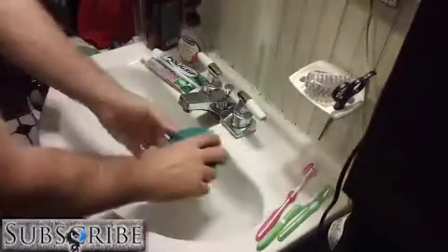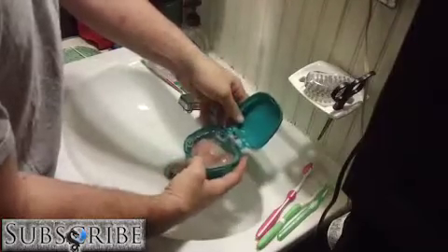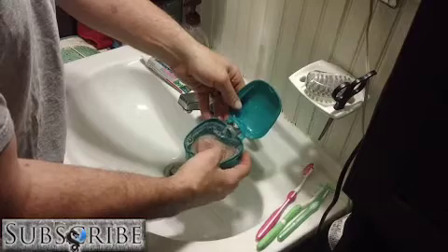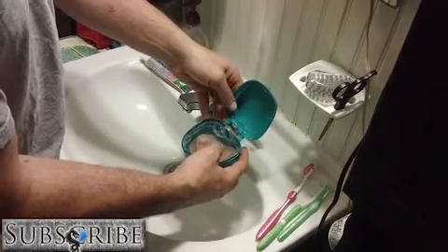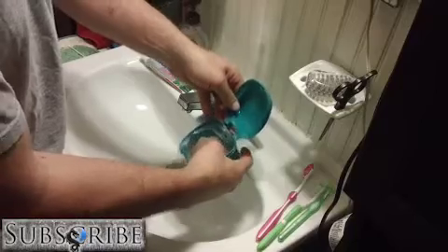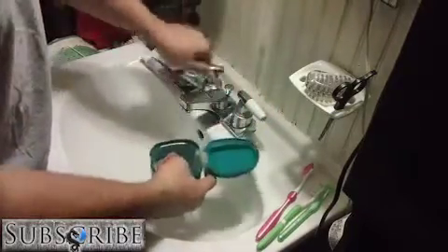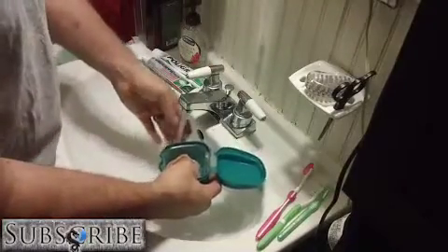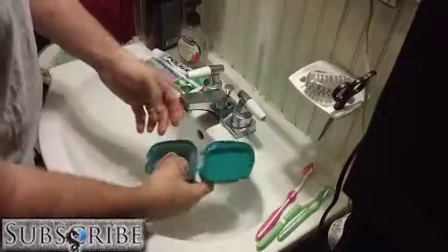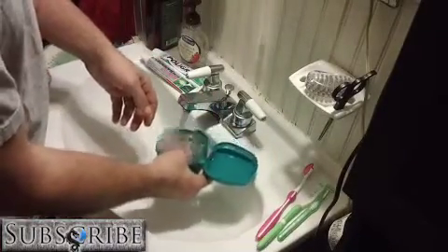So I take it, I usually switch it around. It kind of looks like that. You have bubbles. The water will be cold and a little bit thick because you had the foaming stuff as well as any glue residue. So I usually put my hand on the denture, dump it out, run some hot water. I'll rinse it out. It's not hot yet, it's cold. So I'll rinse it out. It's got kind of a minty smell, it smells good.